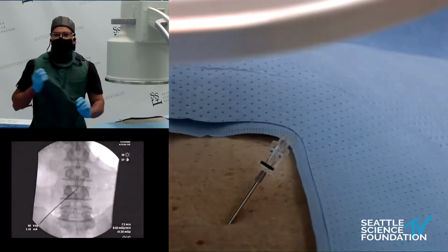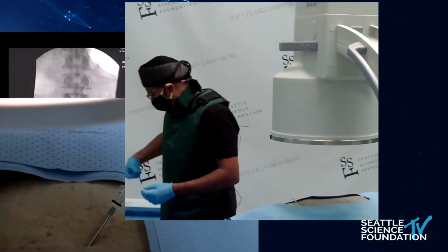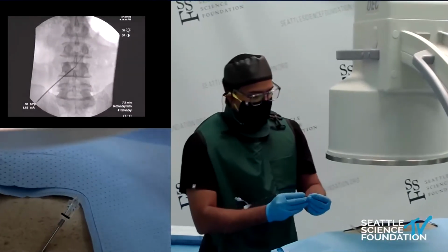And there we go. It actually went in very easily. So I confirmed I'm in the epidural space with the use of that guide wire.